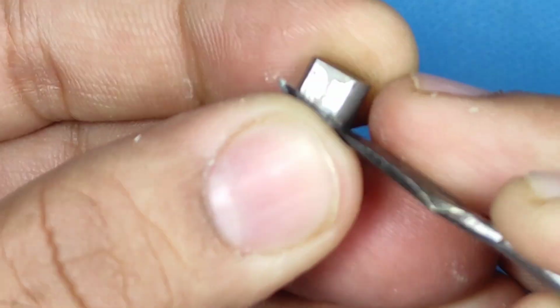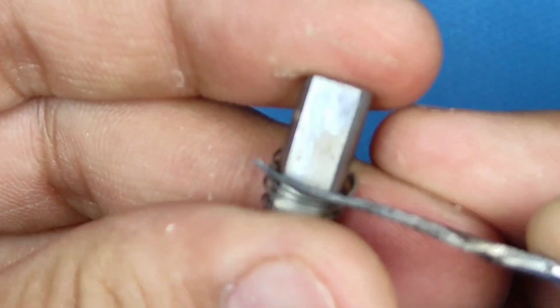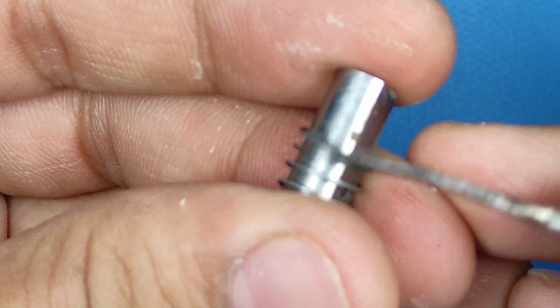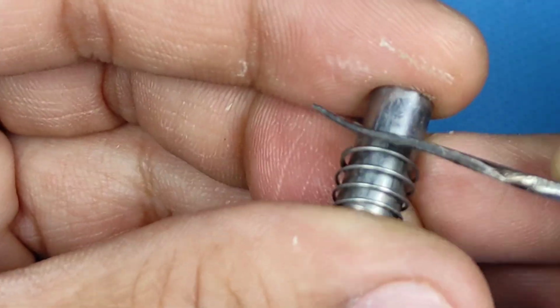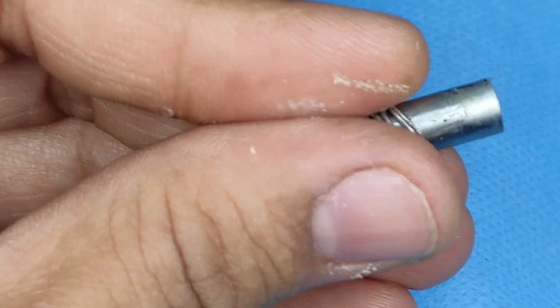Okay, now we come to the main culprit why the water is not coming out. It is because of these scales. You can see a light gray colored material on the surface, and I'm trying to scrape it up. Because of the reflection of light, it might not be clearly visible. I will try to focus it and make it visible to you. You can see some amount of white powder on my fingertips. Okay, so those are the things that are happening, and this is the main reason for it to happen.